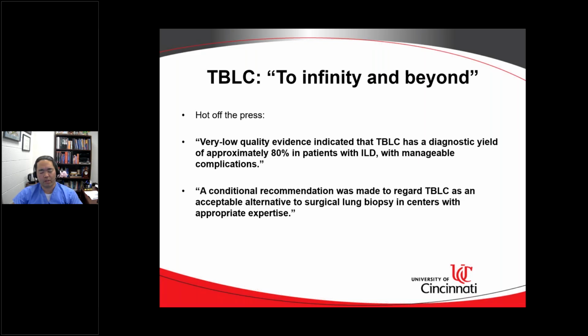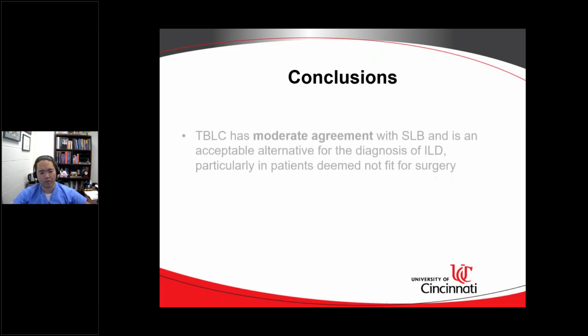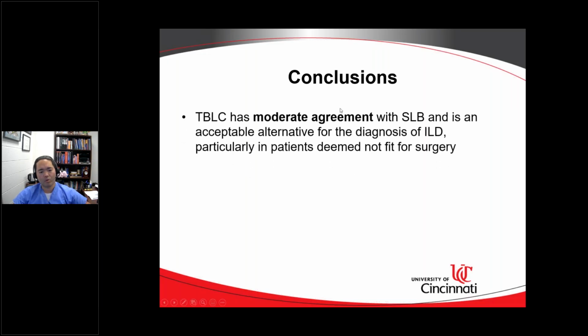And yes, that's one thing that I will make a remark on as well. So hopefully in the past less than an hour, I was able to communicate a few things. One, that right now we have great evidence that transbronchial lung cryobiopsy has moderate agreement with surgical lung biopsy, and it's an acceptable alternative for the diagnosis of ILD, particularly in patients that are not fit for surgery. Obviously, the patients that can undergo a surgical lung biopsy, by all means, that's the gold standard. That's what we know the best. Please submit your patient for surgical lung biopsy.